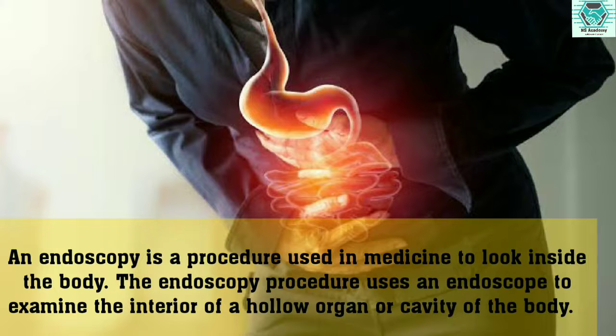So how long does the upper endoscopy procedure usually take? It takes between 15 and 30 minutes. The endoscope doesn't interfere with the breathing, and many people actually fall asleep during the process.